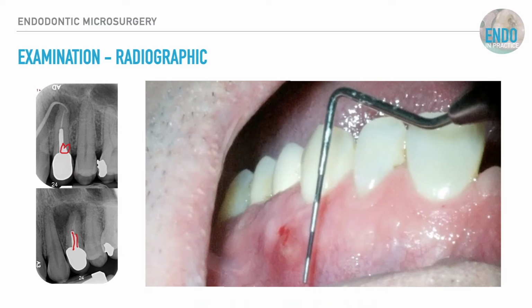But in a premolar with 2 converging root canal systems, that is most likely a little delta at the end of that. How am I going to guarantee that I can then negotiate that delta to make sure that I have apical patency, which is important for endodontic retreatment, especially with periapical radiolucency? So based on all those factors, endodontic surgery is looking more appealing because of the difficulties that I can't guarantee with my orthograde dismantling of that.